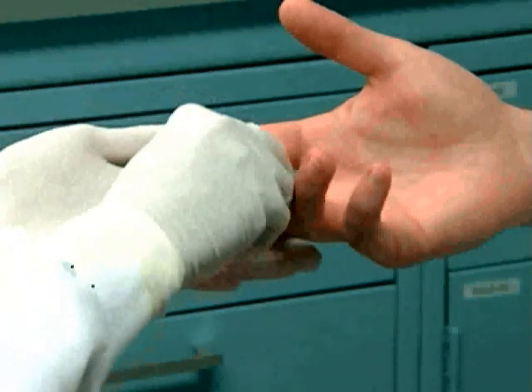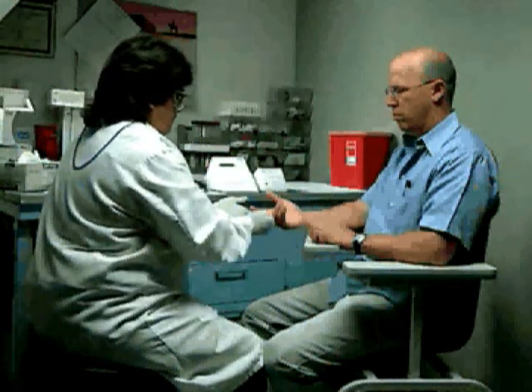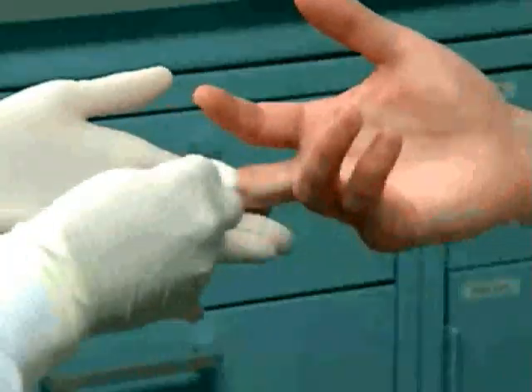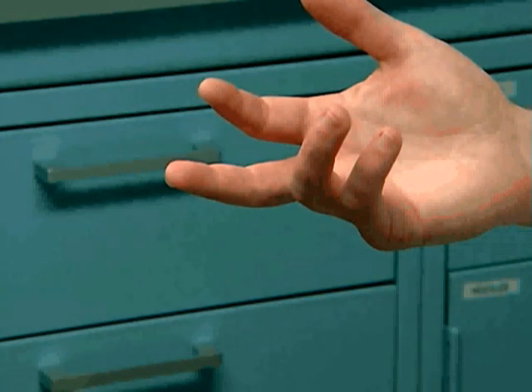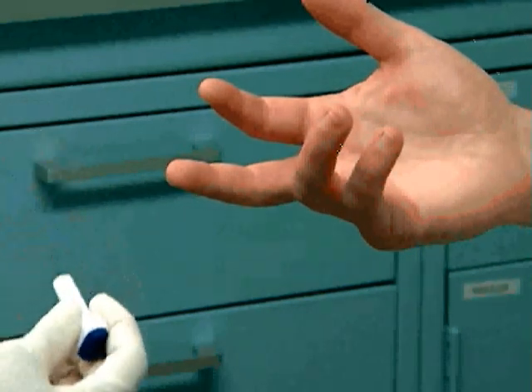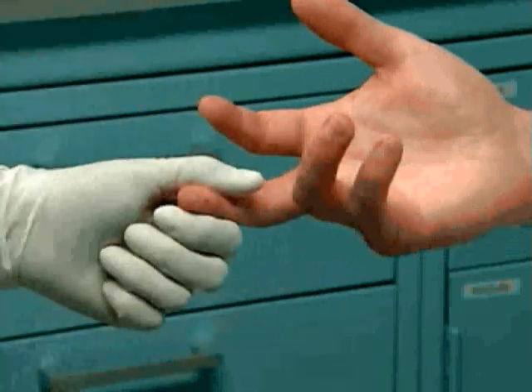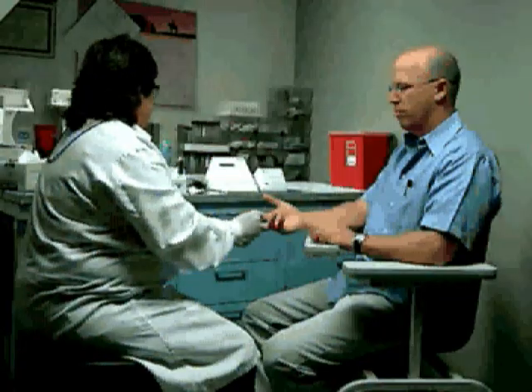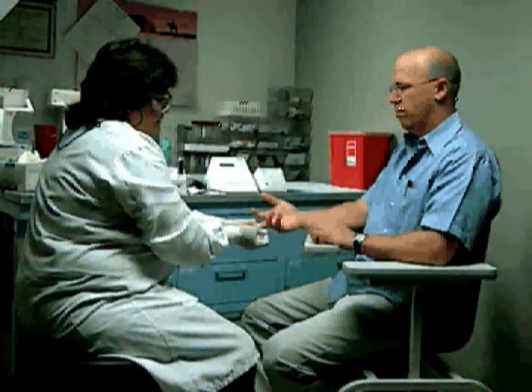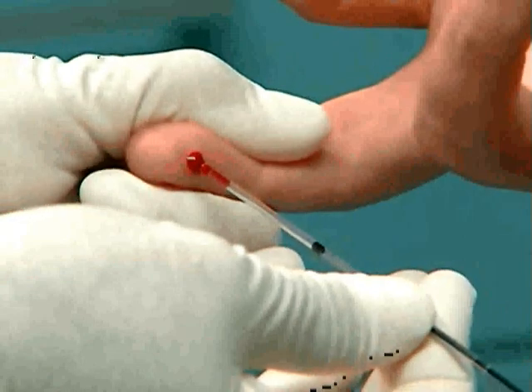Clean the fingertip with a solution of 70% isopropyl alcohol, then dry the finger with a gauze pad. The finger should be clean and dry to avoid hemolysis and to remove any traces of glycerin-based hand soap or lotion that could affect triglyceride results. The best place to take a sample is the palmer side of the middle or ring finger on either hand. Select a site free from calluses and scar tissue, hold the finger securely, and perform a deep and firm puncture. Wipe off the first large drop, then gently but firmly press the finger until a second large drop forms. Hold the finger downward and gently apply pressure to the surrounding tissue to make the blood flow more freely. Hold the capillary tube at a slightly descending angle to the drop of blood and the tube will fill.